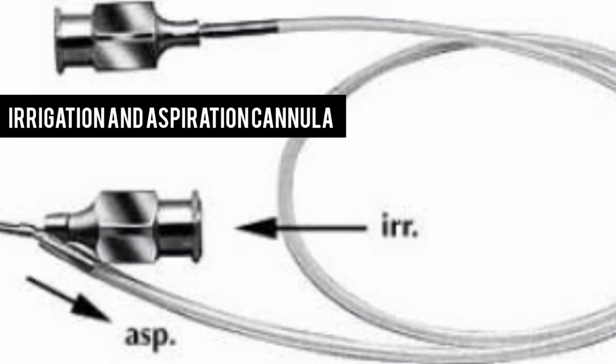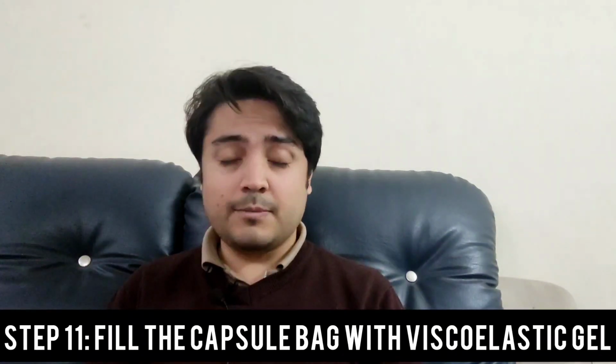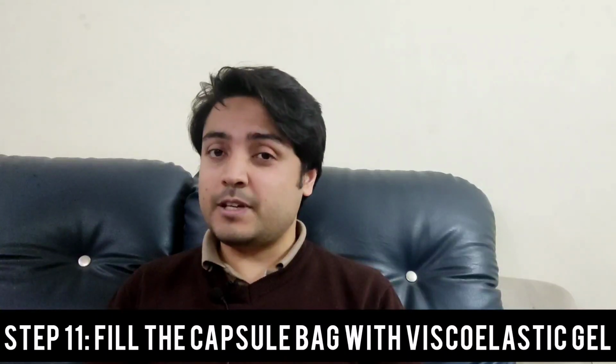Now this cannula that is used in OT procedures mostly is such that the irrigation and aspiration are done at the same time, so it is called an irrigation aspiration cannula. You will see this once you go into OT, or you can see it in the image here. Then the capsular bag is inflated by viscoelastic gel again to keep the capsule in its place. Then comes the part where the intraocular lens is introduced.